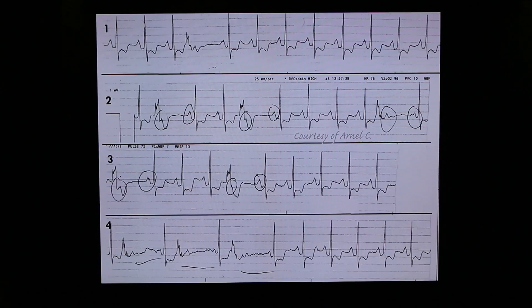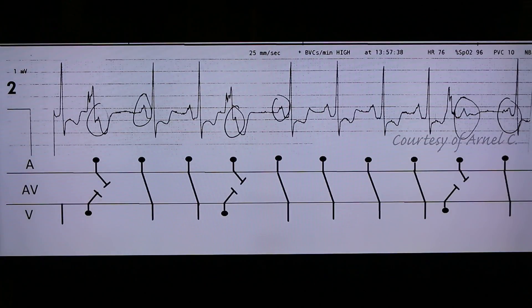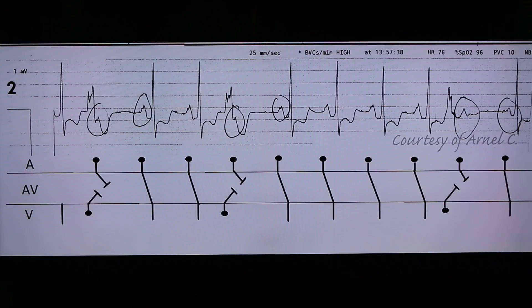We cannot simply see deflection of PVCs conducting retrograde to the AV junction, but it manifested as a blocked P wave. The ventricular impulse went up to the AV junction and made the AV junction refractory. The sinus impulse then cannot conduct via the AV junction because it is still refractory. So what we see on the surface EKG is a block, or non-conducted P wave.